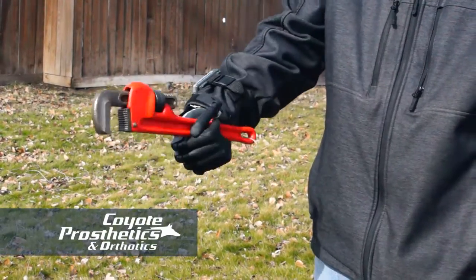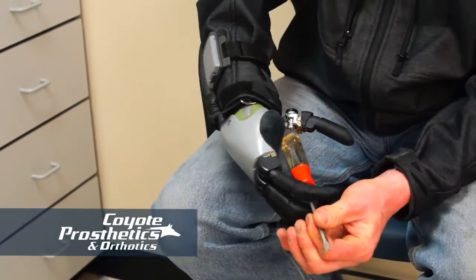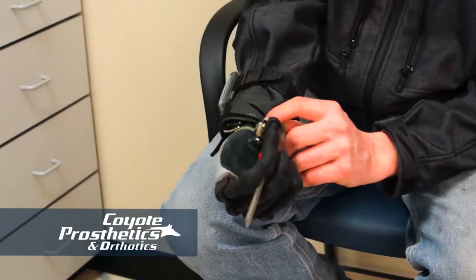Holding a coffee cup, it would probably hold it. But I would be worried, since I don't have any feeling, about dropping the cup or tipping it and not realizing it and spilling it. So I don't hold glasses or cups very often with it. I can pick up books, magazines, briefcase. I can run wrenches, hold a screwdriver. There's a lot of things I'm sure I'll be able to use it to do — I just haven't had it long enough to test it out and get comfortable using it that way.